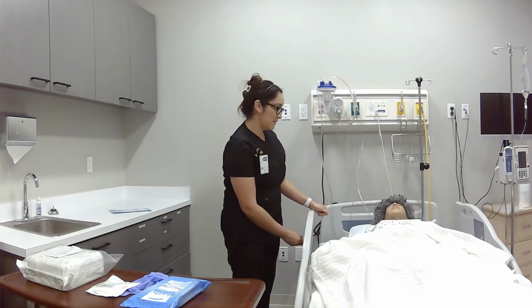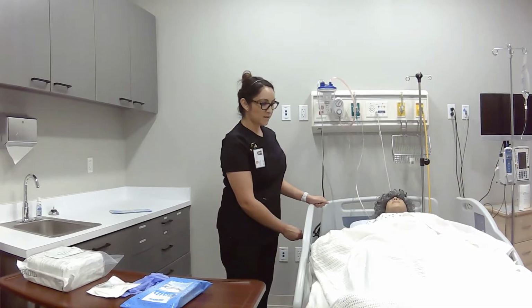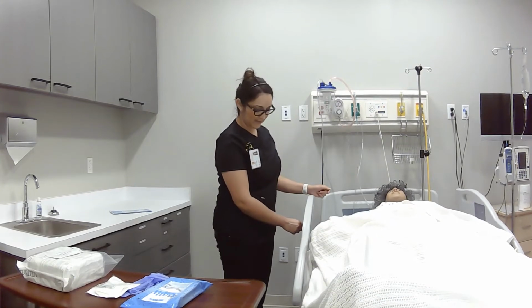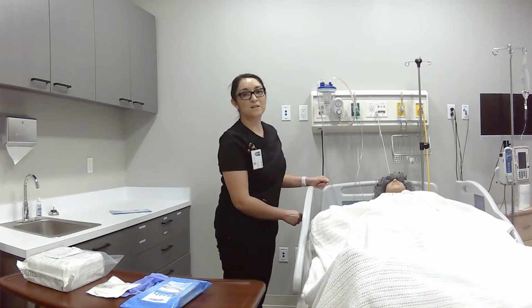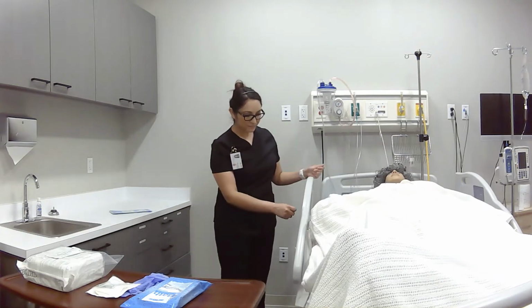So we're going to bring the bed to waist height, because you don't want to be bending too much because it's going to hurt your back. Back safety is very important. Make sure you're practicing good body mechanics when you're doing patient care. Okay, that should be about right.